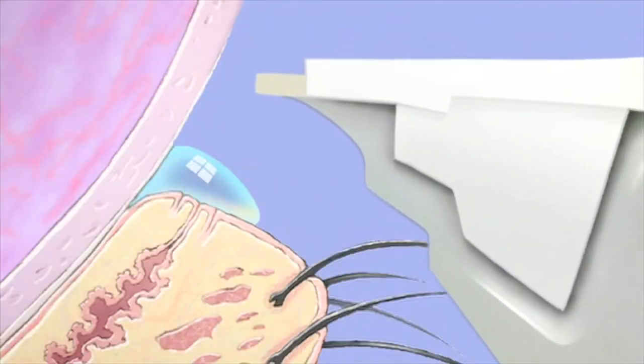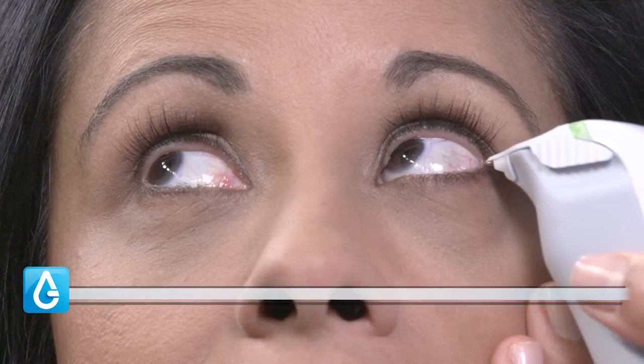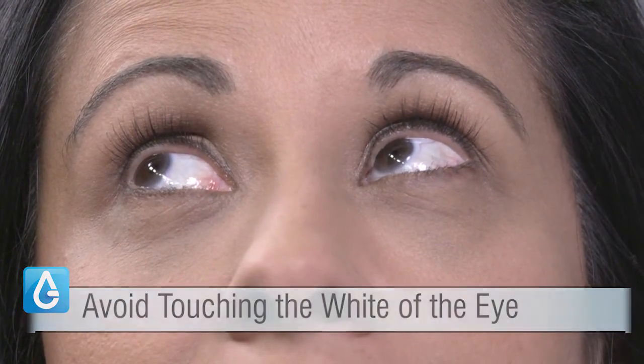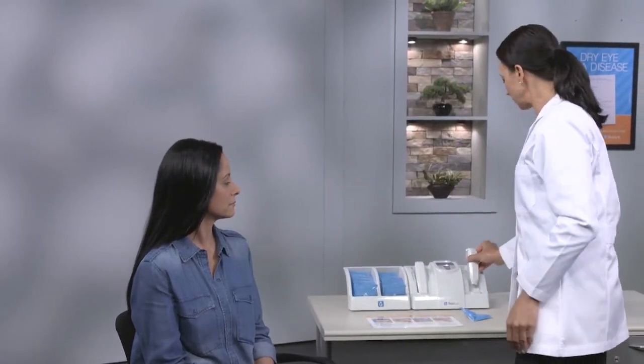Position the pen beyond the eyelashes near the corner of the eye. Tears are collected on the bottom of the tip of the test card. Lower the pen until the bottom of the tip touches the line of moisture on top of the eyelid. The tip should actually come in contact with and touch the top of the eyelid, but avoid touching the white of the eye.